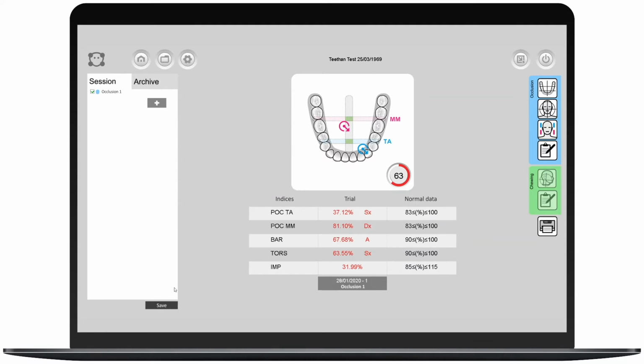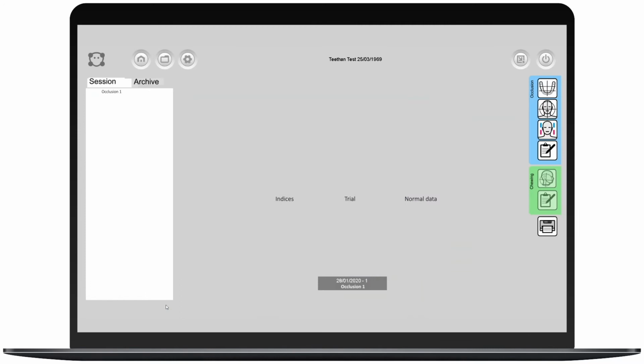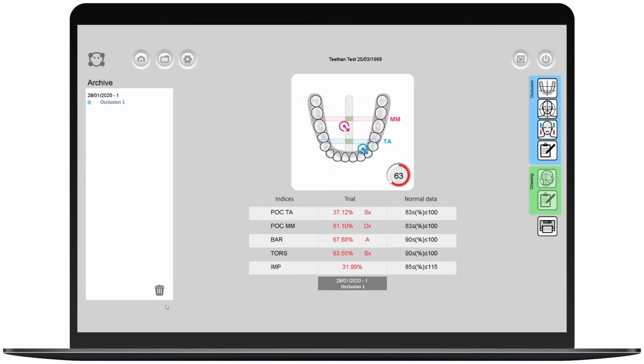At the end of the test session, you will be asked to select the test or tests that you want to save. By default, they will all be selected. Only click Save when you want to close the recording session, and these files will be saved into the database.